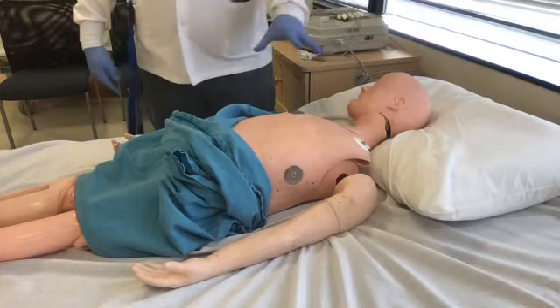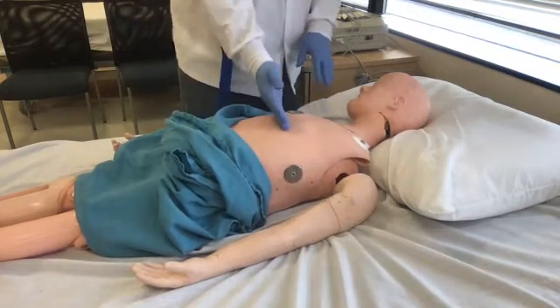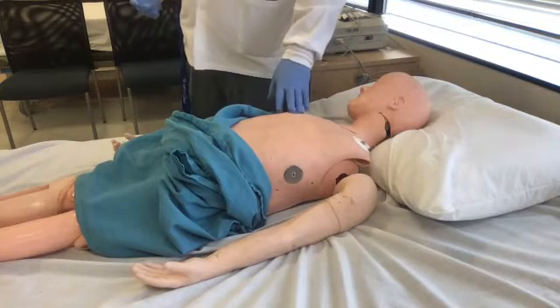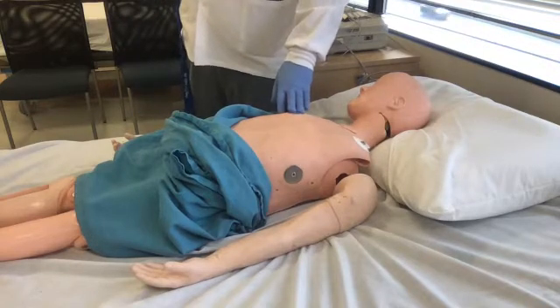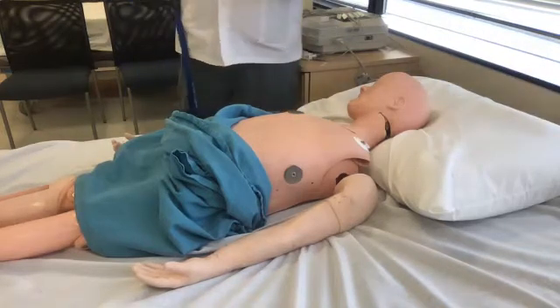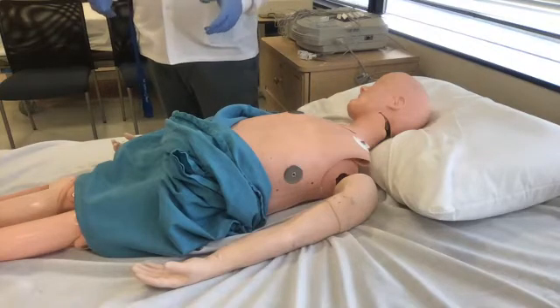But you know what? These are modern EKGs. If you kind of put it around here, the machine will compensate, okay? Because that's how sensitive machines are, and they're a lot smarter. During my time, you might even see this now because it's still a reliable machine 25, 30 years later. It's called a Burdick EK10.